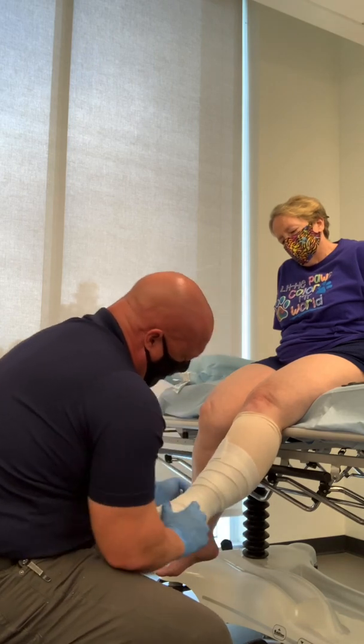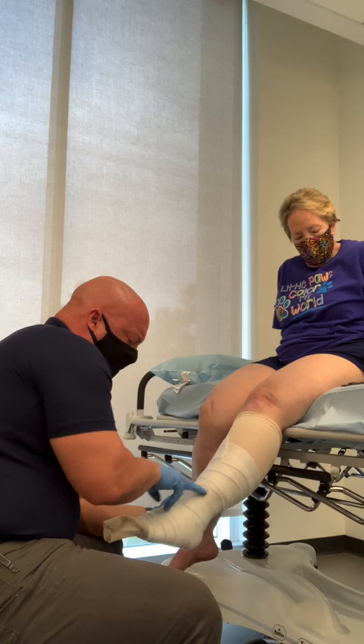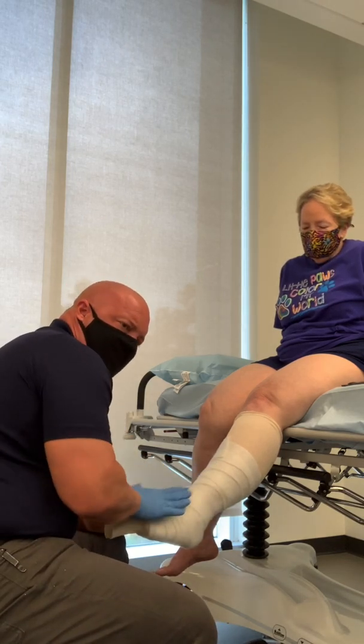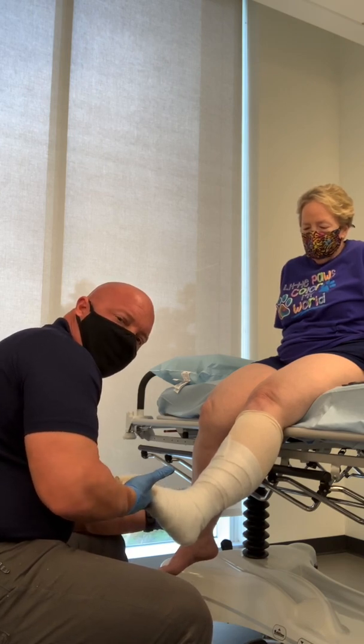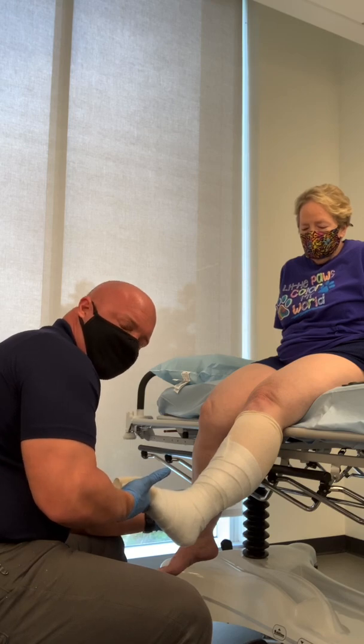We're right at the ankle where the tibia and the fibula come in at the top of the joint — we want plenty of padding. Nice contouring here at the leg. Positioning is key. When we begin to do this, I make sure we're at 90 degrees when we actually start putting the casting material on.